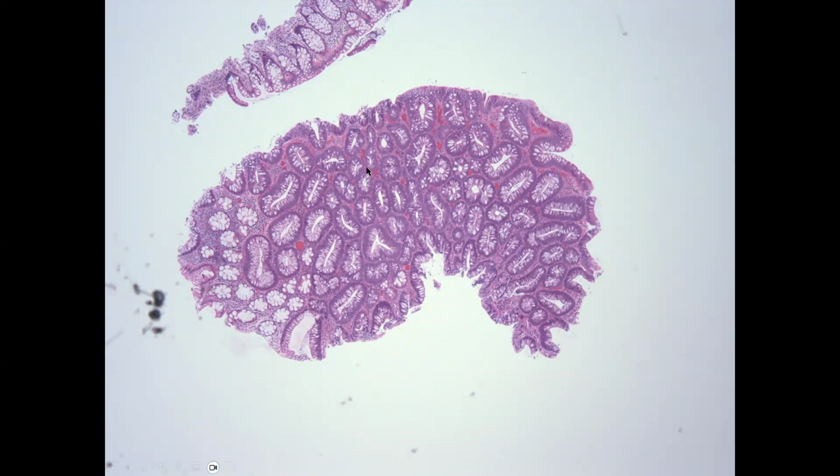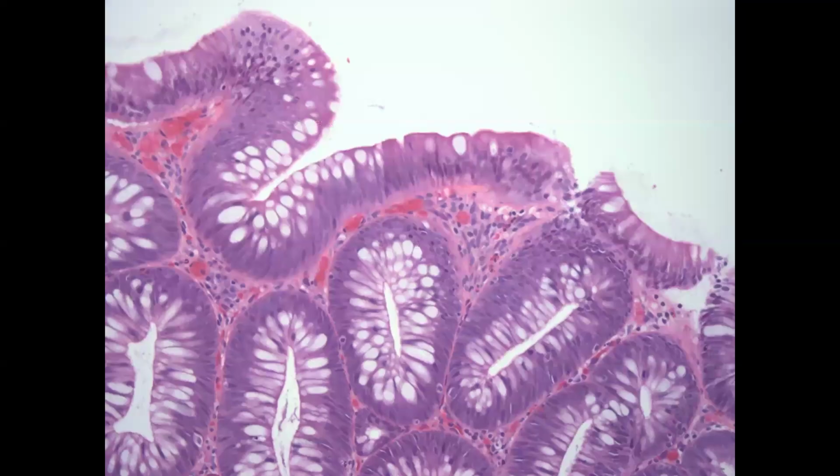On the right side, you can see that these glands look different than the glands on the left side. On the left side, there are nice mucin vacuoles, and the nuclei are essentially not visible at this power. On the right side, the nuclei, which are blue, of course, are really prominent, and even from low power they really stand out. When we look at this on high power, the nuclei, instead of being nicely basally located, are now going up and down, reaching up about halfway of the height of these cells. They're really packed in there. You can't pick out one nucleus from another, and so there's a lot of crowding.